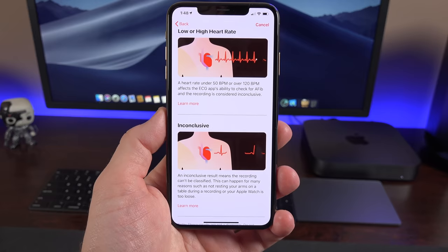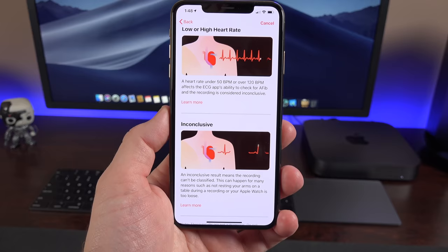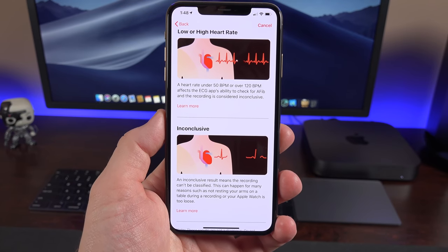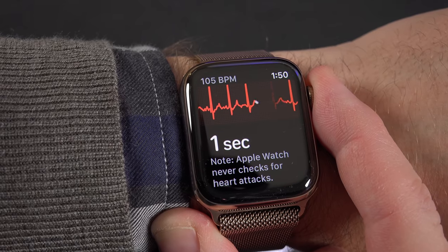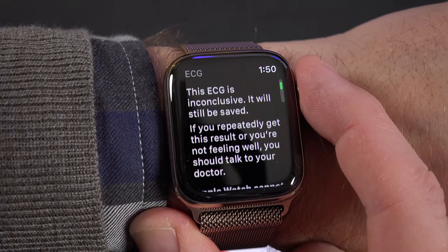If your heart rate is below 50 beats per minute or above 120 beats per minute, the app cannot detect AFib accurately. If you get an inconclusive result, it just means it wasn't able to measure your heart rate accurately or there's something else going on that it can't classify. This probably just means your Apple Watch is too loose or you're moving around and not resting your arms on the table as instructed.